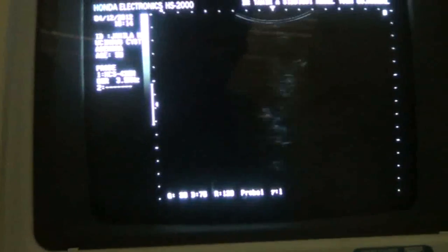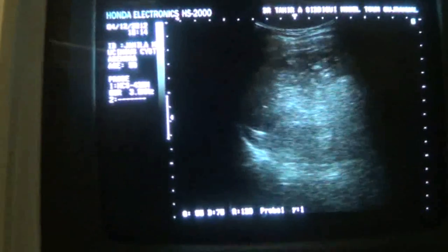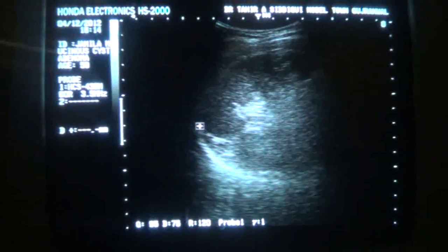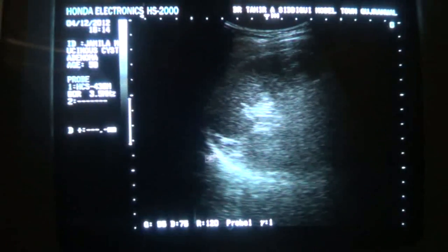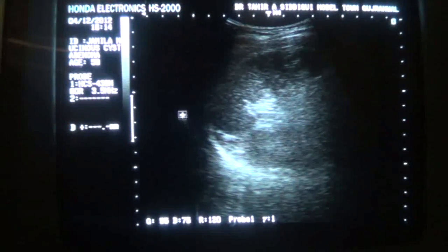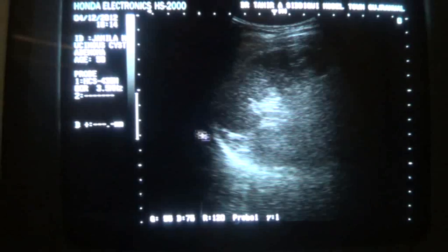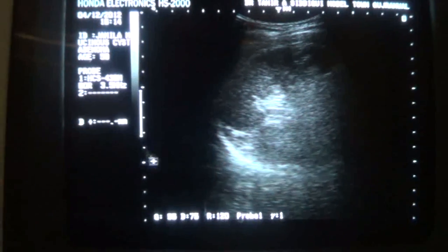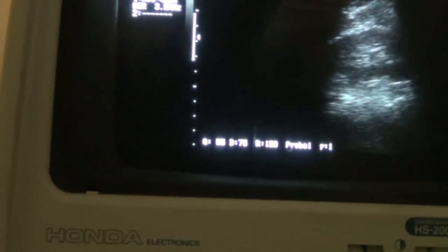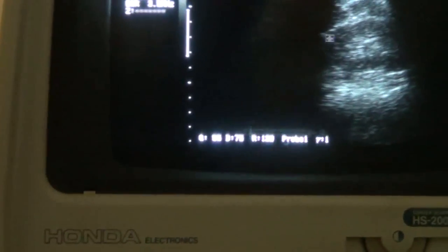Now regarding the spleen and the left kidney — this is the spleen. This is the left hemidiaphragm above it. The left kidney is normal.